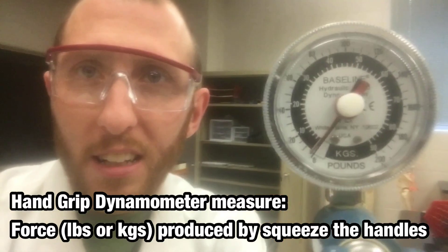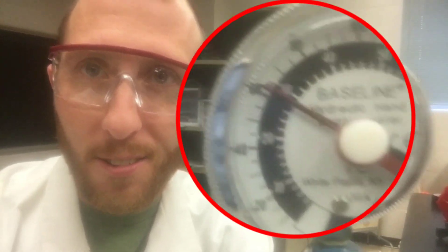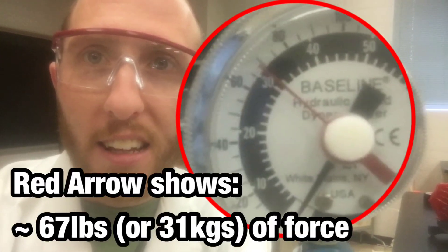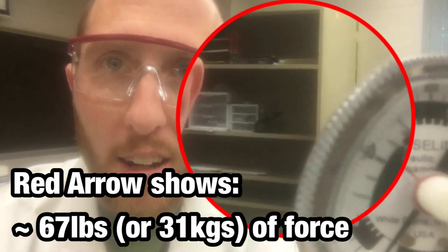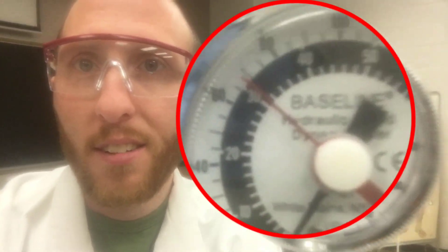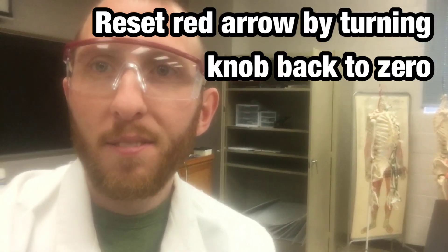First off, the hand grip dynamometer is measuring pounds or kilograms of force. When I squeeze this, you're going to see the red arrow go all the way up until I can't squeeze anymore, and I let go and that red arrow stays on the amount of force that I just squeezed. When you're ready, you reset it back to zero and you can squeeze again.